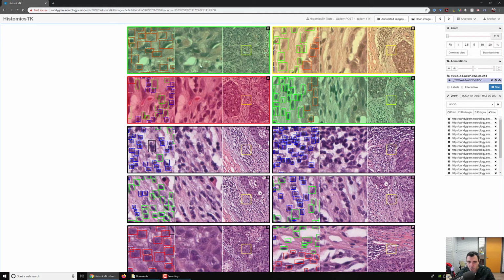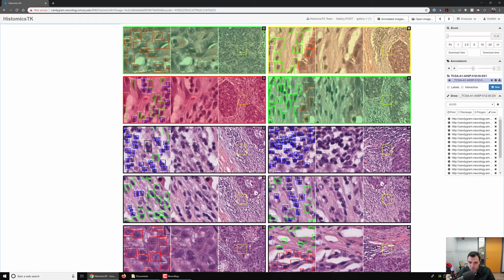Here, just for the demo, I chose to have 2 fields of view per row, and I think here there is 5 per column, but usually for the real scenarios I have usually like 25 per column, so a lot longer, so that they can just pan around.